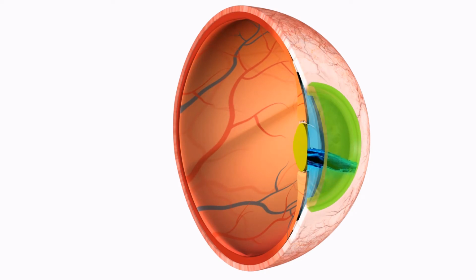Part of the problem is that the difference in refractive index between air and anterior cornea is large and makes the difference in curvature easy to measure. If the anterior chamber were full of air, the posterior cornea could also be more easily measured. However, the refractive index of aqueous humor is similar to cornea and makes the subtle difference in curvature difficult to detect.